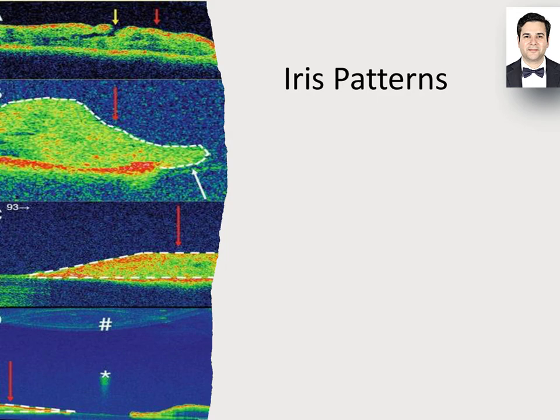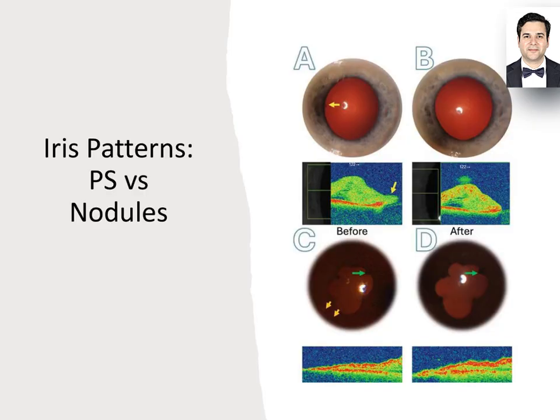Rather than simple IPE lens adhesion, AS-OCT reveals an extension of fibropigmentary layers from the anterior limiting layer attaching to the lens, a new insight provided by AS-OCT. One of the most striking observations is that with effective corticosteroid therapy, the hyperreflective anterior limiting layer can actually return, and nodules may resolve. However, in cases of chronic synechiae, these changes tend to persist.